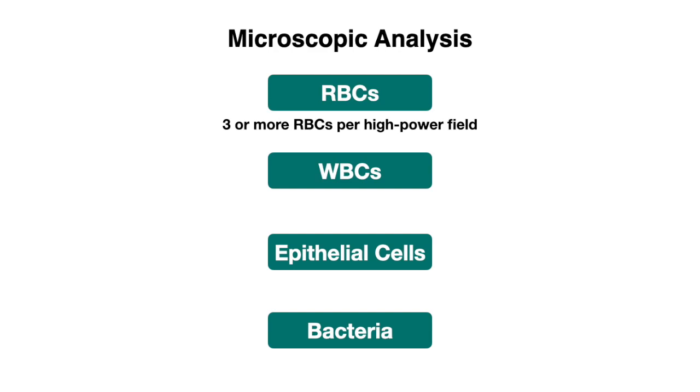And so in the appropriate clinical setting, cystoscopy and imaging can be recommended to rule out those causes. Let's now move on to our white blood cells. Neutrophils are the most common white blood cells that we find in urine, and they can indicate an infectious or inflammatory process ranging from UTIs to STDs to kidney stones.